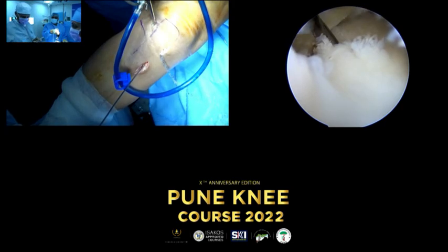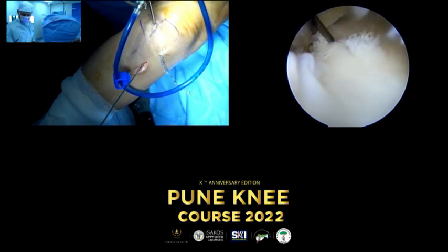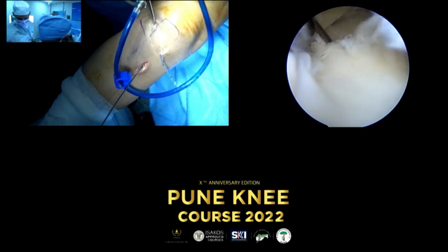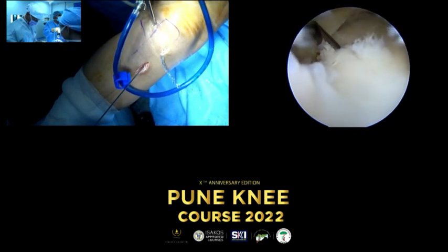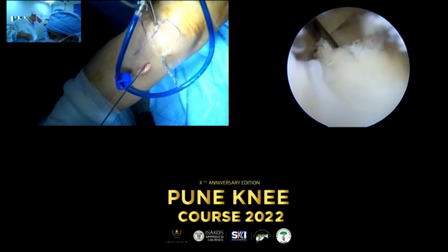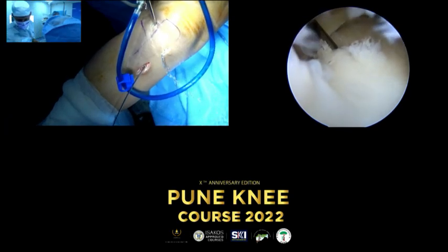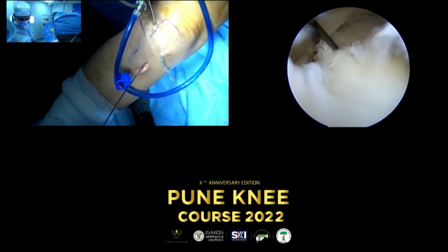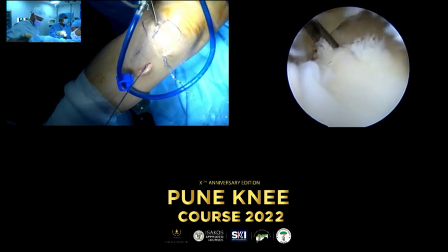What size is this? This is a 5? Yes. That's from Comet? Yes. That is for the button. But why doesn't it fit? Five, it should. What is this? It's too short. Let's see, this is a 5? Yes. But probably this is not from Comet?